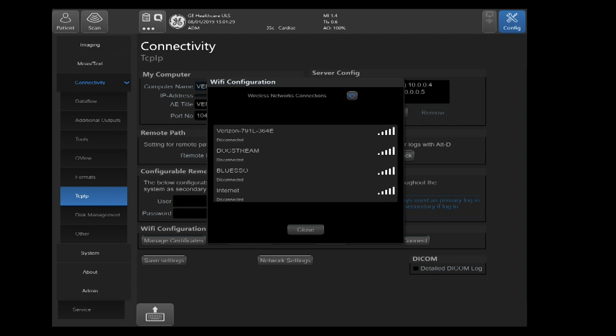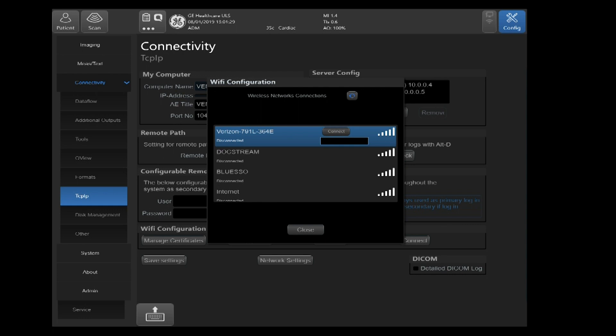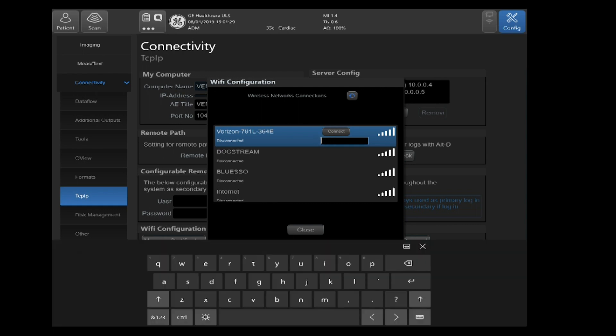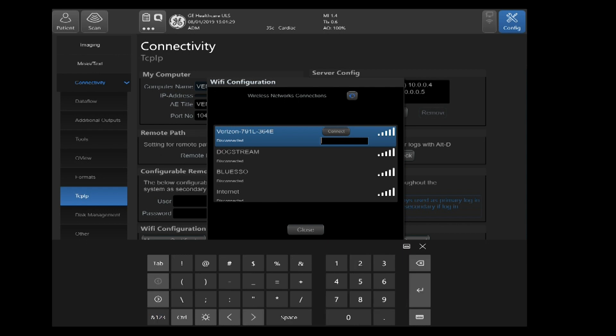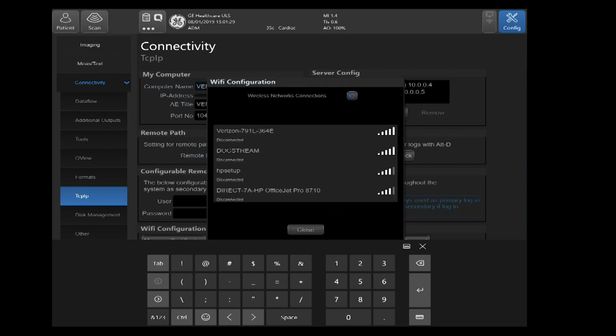Once you select your Broadcasting Network, you'll see the ability to change your Wi-Fi password or enter it. You select that field and then you go ahead and enter your password and select Connect.